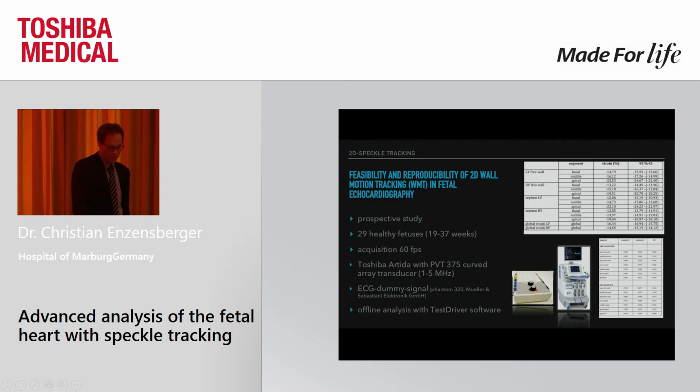When you read different papers, you see that most of them, or more or less all of them, use sector probes. We did not. We used a convex probe with 1 to 5 megahertz.